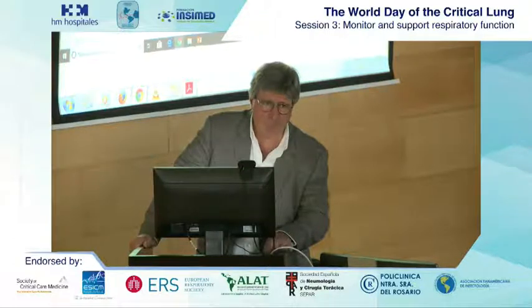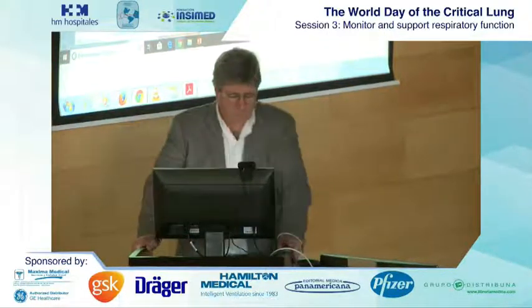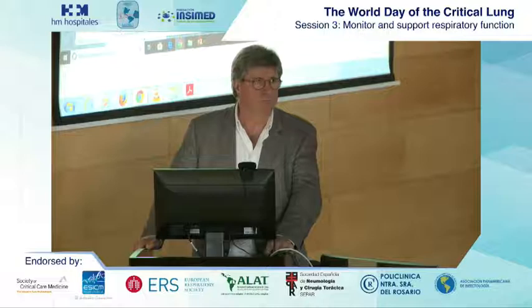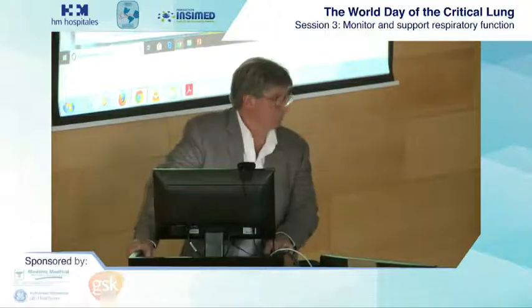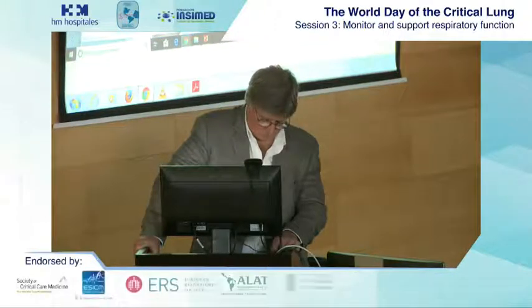Yes, I think it must be a concern, and I'm not sure that we should restrict tidal volume among these patients without ARDS. I think that they have less severe disease, so frequently they have spontaneous breathing, so it's very difficult to keep a strict control of the tidal volume. So I'm afraid of limiting the tidal volume among these patients. And I don't know how to do it, because they are on pressure support, they have efforts, so it could lead to asynchrony that could be worse than the benefit of limiting something in a non-severe disease, in a lung that could receive a higher tidal volume.